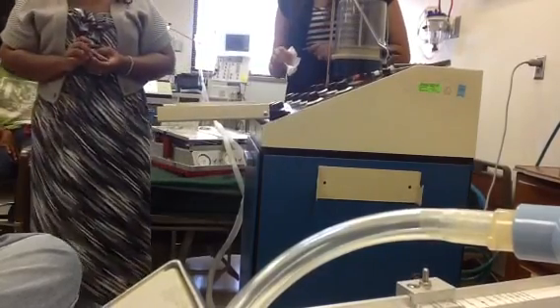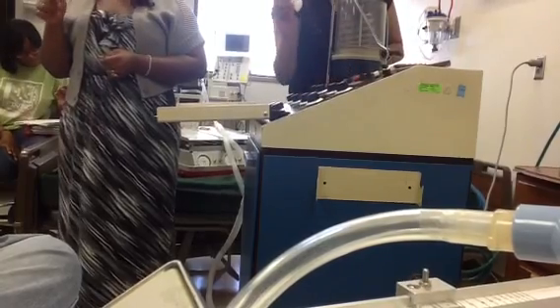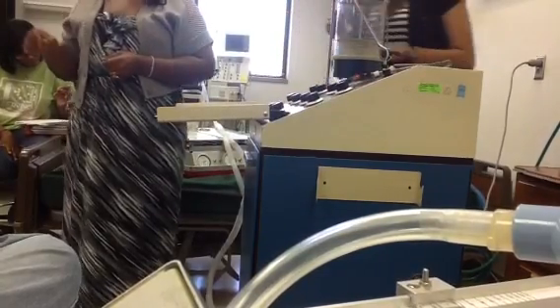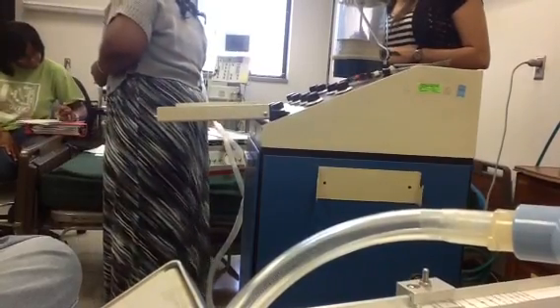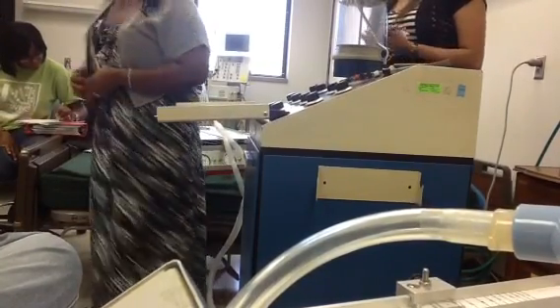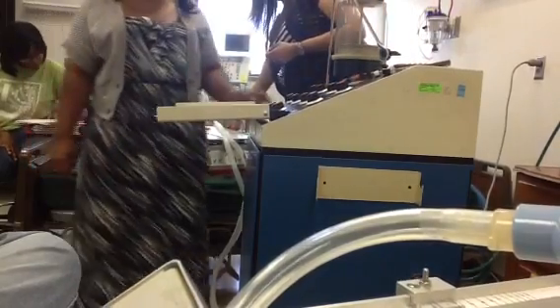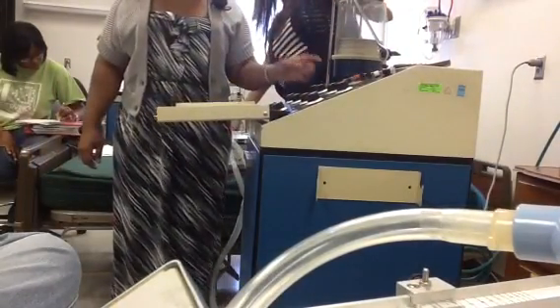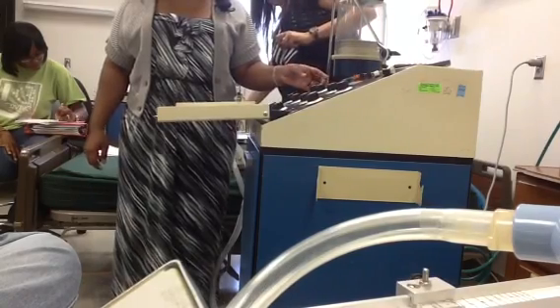Sensitivity. You set it when E is... you increased it until the auto cycle, and then you decreased it back a quarter turn. Now you need to check it, so you'll watch for your patient to pull a breath. Make sure the assist light will come on, so you want to see how far back the needle goes before they get an assisted breath.